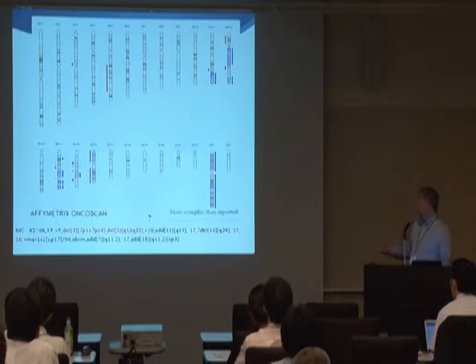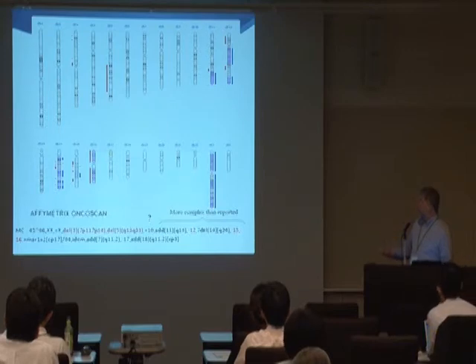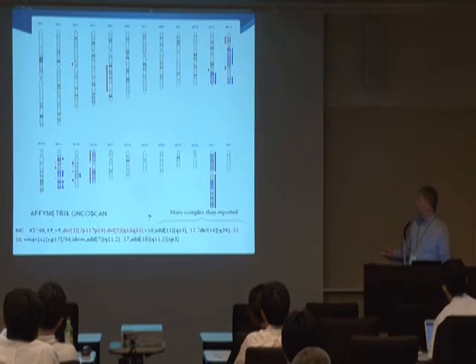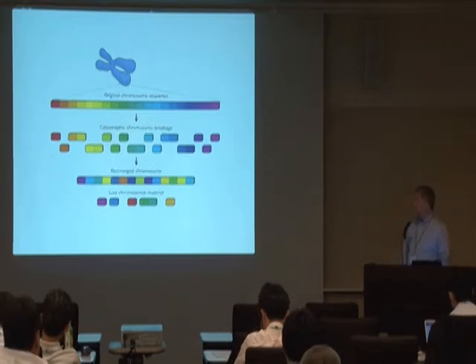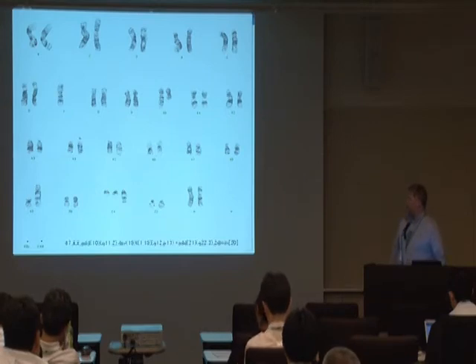And then when we look at this region here, which we reported as such in metaphase cytogenetics, we can see a much more complex pattern of rearrangements, especially involving chromosome 14 and chromosome 15. So we hadn't appreciated that there was this level of complexity with these two chromosomes. And of course, Laura had mentioned chromothripsis before, and this is probably indicating that there was a fairly significant chromothripsis event in this patient, obviously indicating a poor prognosis.